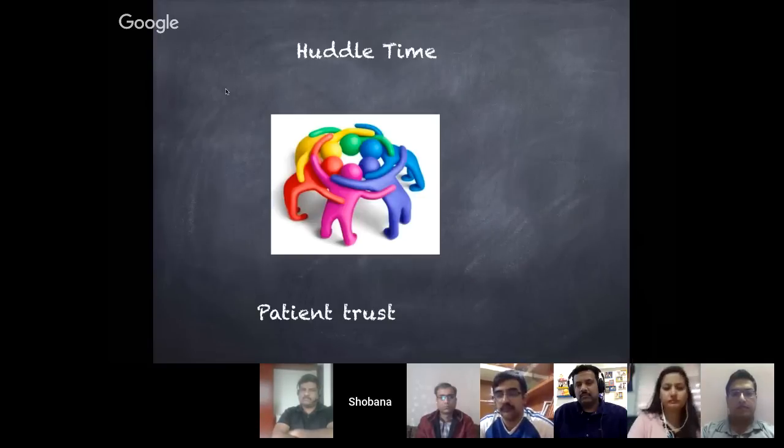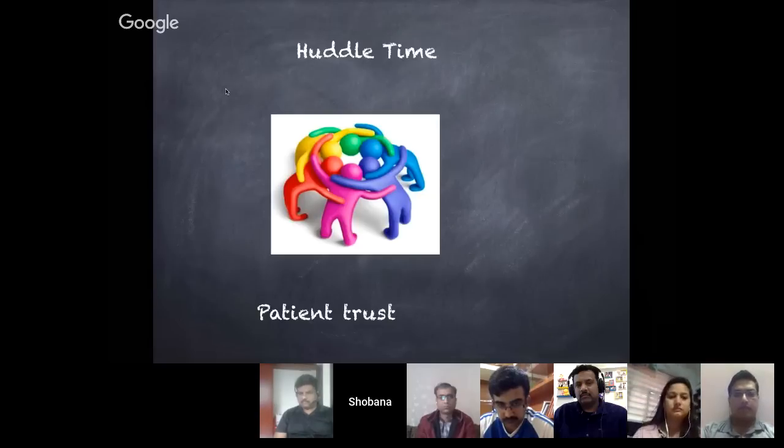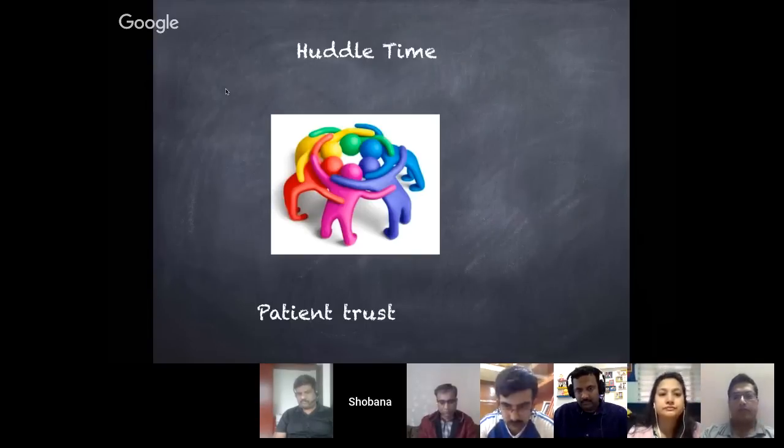Great. We have a wonderful team for you today. Hi, I'm Dr. R, your anesthesiologist. Hi, I'm Miss B, your scrub nurse. All right, so we'll go to sleep for the first part of the procedure. We will pin the head turned to the right and the left shoulder up. Once the dura is open, we will wake the patient up on the pins, which will be followed by testing and tumor resection. You can put the patient back to sleep for the MRI scan to check for the adequacy of the tumor resection, and we will resect more if necessary. If not, we will close and wake up. Do you have any questions? No.